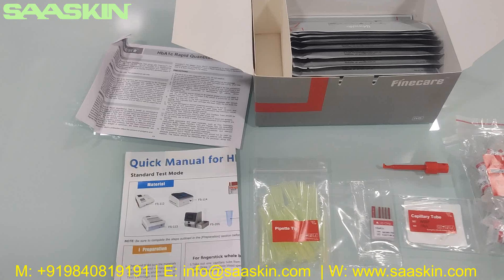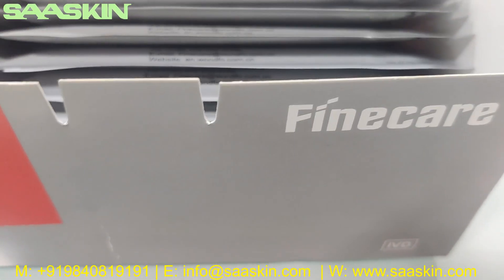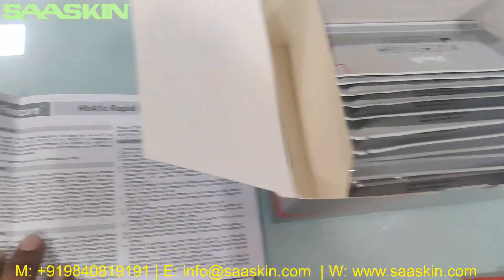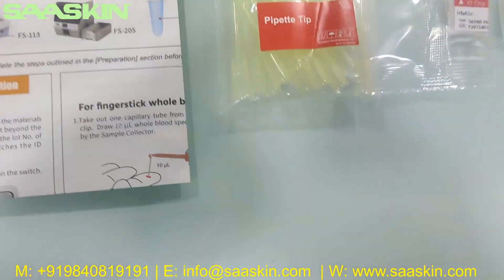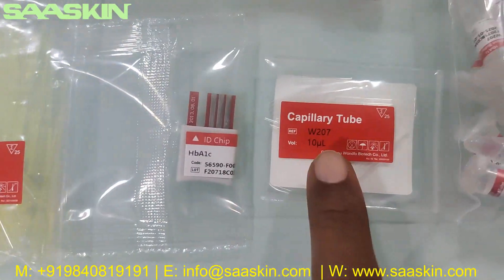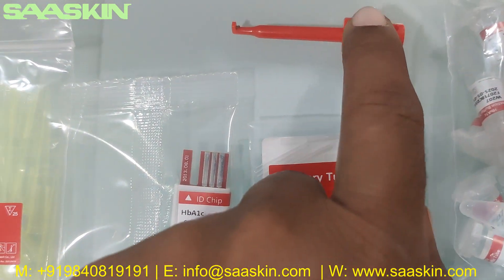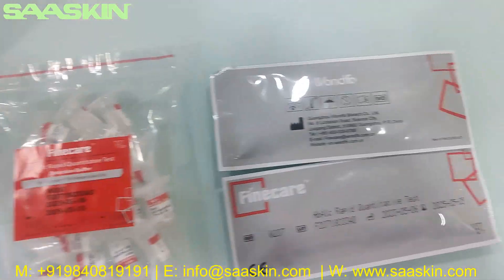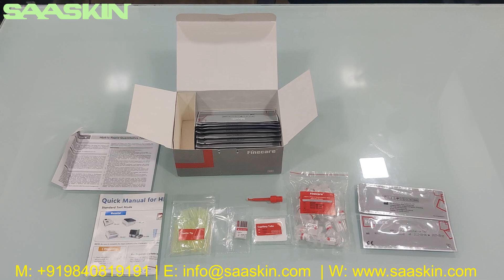Just quickly to summarize: today we are seeing the unboxing of Wondfo Finecare HbA1c Rapid Quantitative Test kit, to be used in the FIA meters only. In the 25 test kit box you get one IFU brochure, one quick manual for completing the test, 25 pipette tips, one ID chip, 25 pieces of capillary tube, one capillary tube clip, 25 detection buffer pieces, and 25 test cassettes. This is how the total test kit looks like. Thank you.